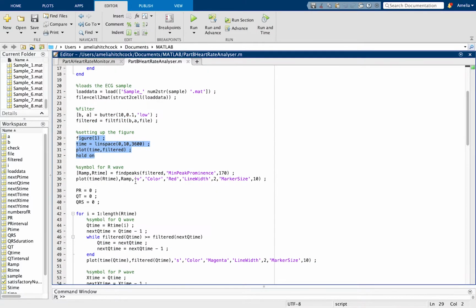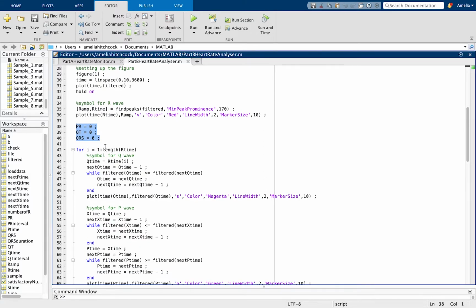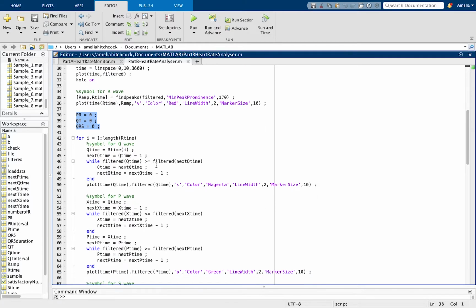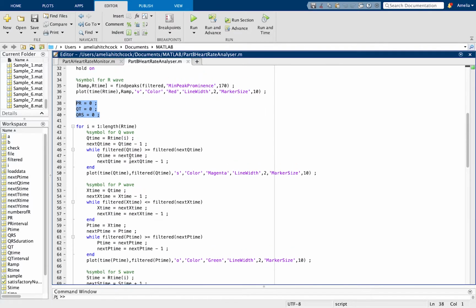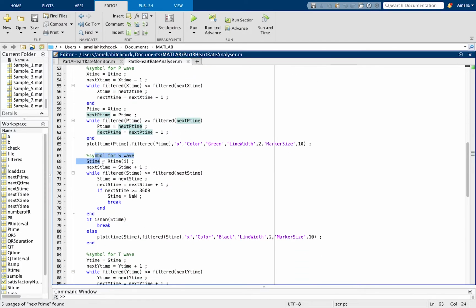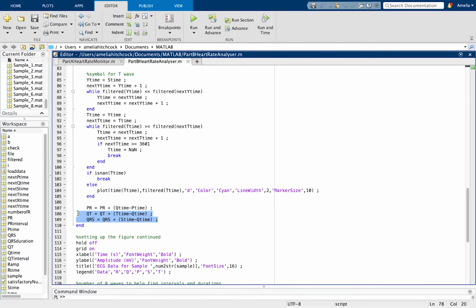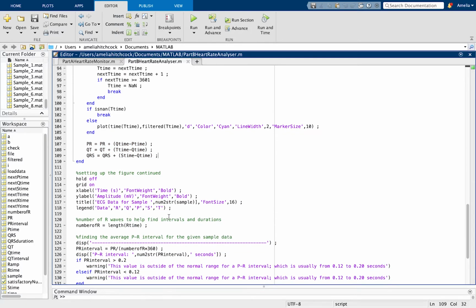Sets up the figure. It then finds the R waves and gives a symbol to them. I just put this here so it can help me find the intervals and the durations in the command window later on. I then create a for loop and I start for the other symbols. This is for the Q wave symbol, this is for the P wave symbol, this is for the S wave symbol, the T wave symbol, and then here at the end, this is just to help me with the command window. This is just me setting up the figure.